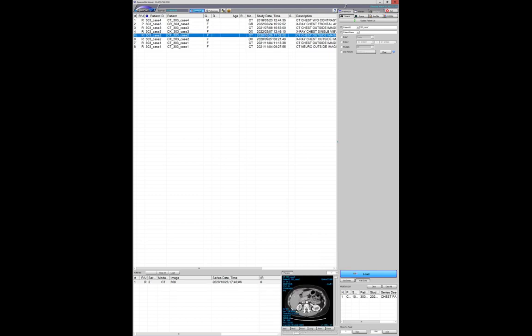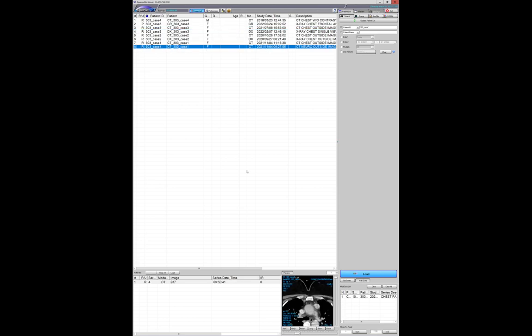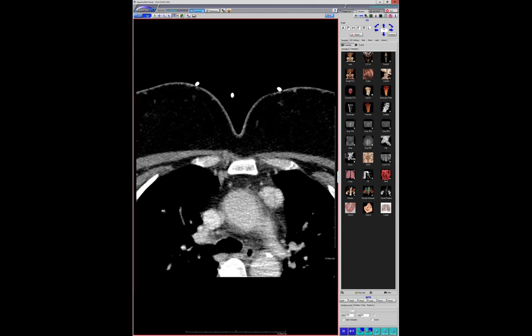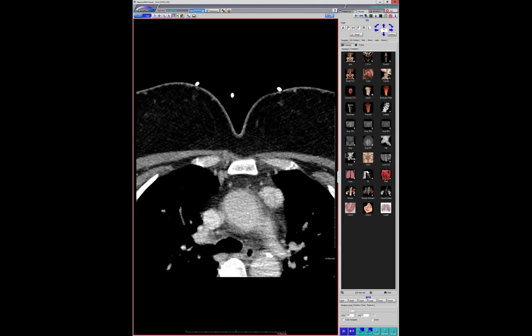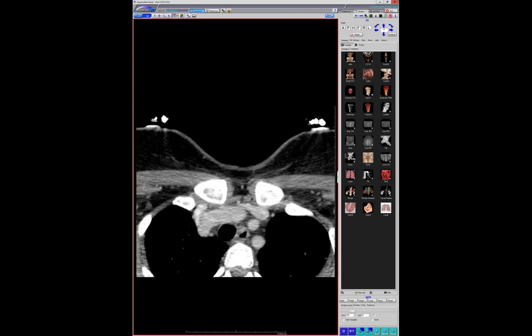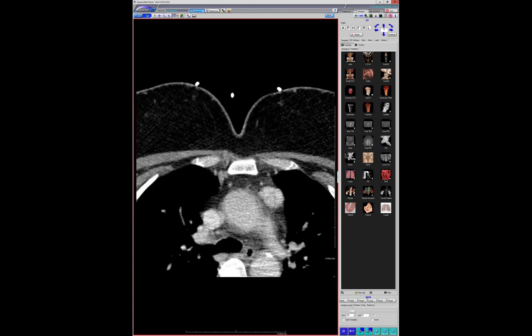I will come back to this last case. From the CT there was just a very hypervascular lesion — quite arterially enhancing with persistent enhancement. I gave the differential diagnosis: large parathyroid adenoma, paraganglioma, ectopic thyroid tissue, Castleman disease, and I always throw in hemangioma. Those are my five hypervascular lesions in the anterior mediastinum.